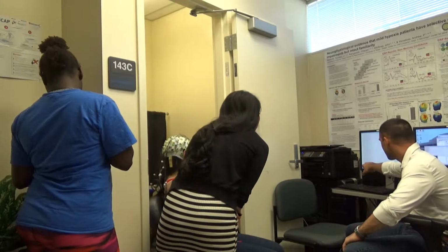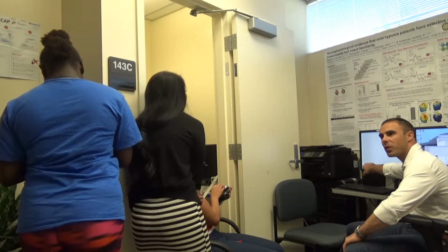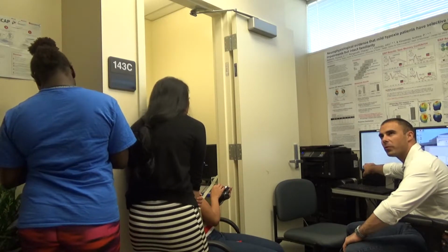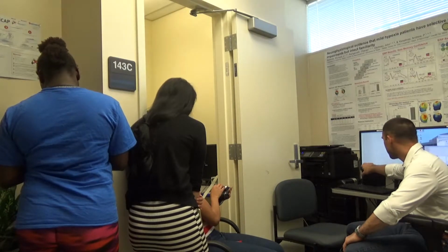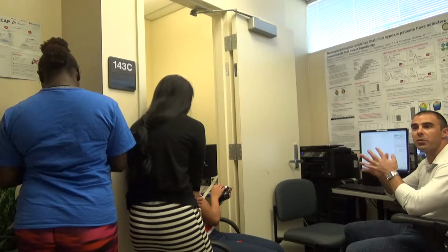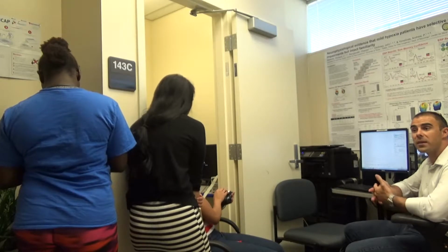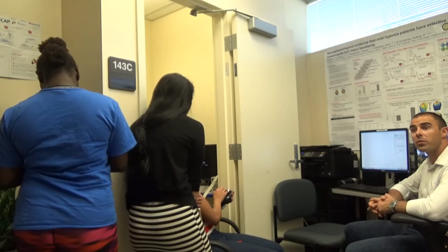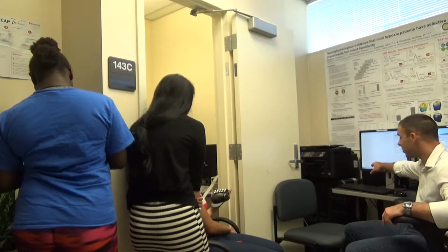So 62 is one of our event codes. It meant the trial was old and probably from the man-made condition. And then we would concatenate that with the item and the source response that was given later to create our 4-digit code that you then use for your event lists and your bin operation files. So it ties together all the computer work that we do to analyze the data. And where does that come from? Well, it comes from logging those trials.